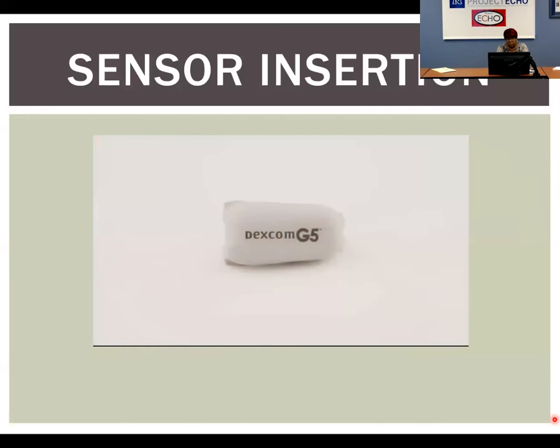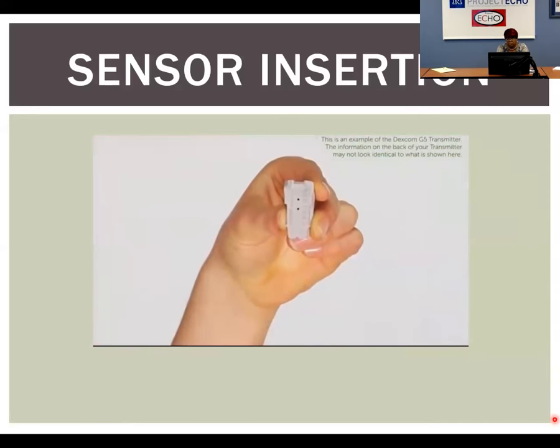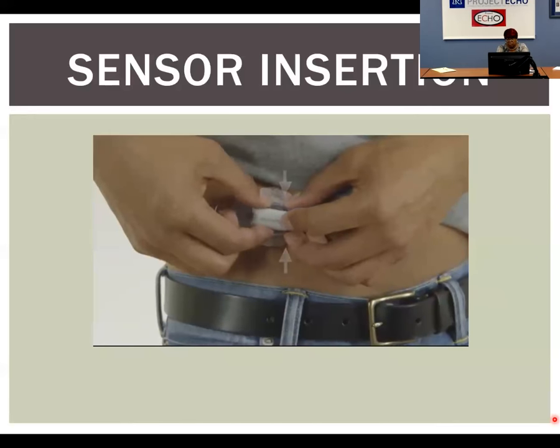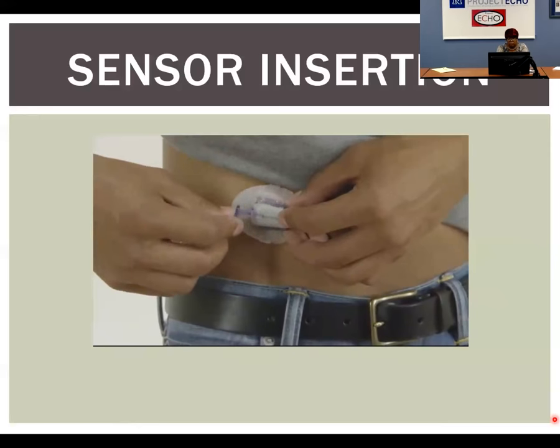Once your sensor has been inserted, it's time to attach the transmitter. First, if you haven't already done so, clean your transmitter with an alcohol wipe and let it dry. Once it's dry, place your transmitter into the sensor pod, flat side down, thinner side away from the transmitter latch. With one hand, you may want to pinch up on your skin at the front tips of the white adhesive. Use a finger to hold the transmitter in place. With your other hand, move the transmitter latch forward until you hear 2 clicks. This may take some force.